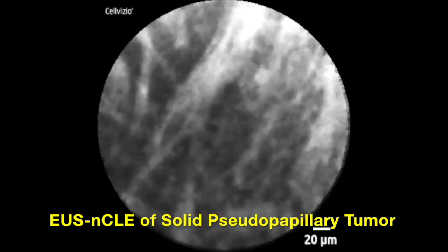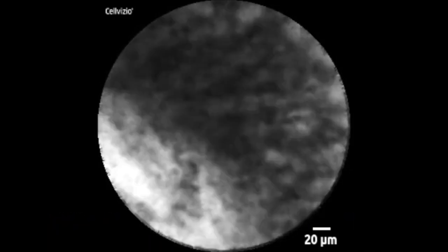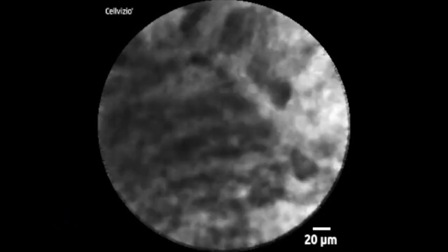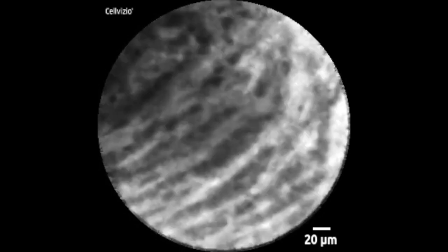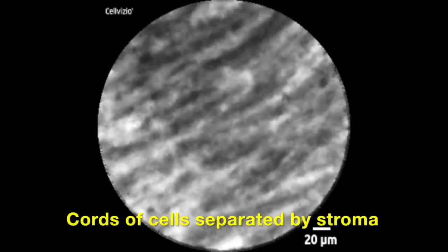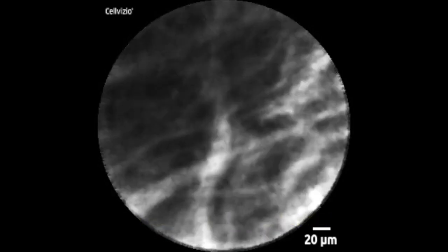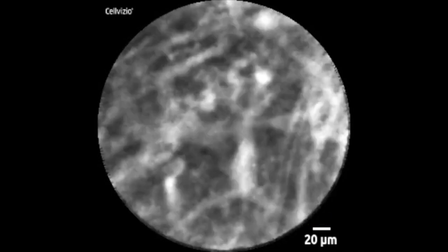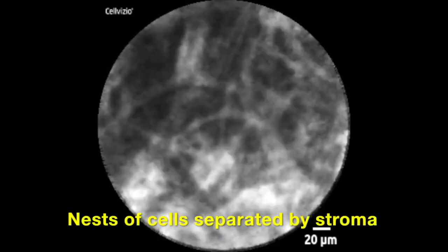Here is an example of solid pseudopapillary neoplasm. Again, very similar to the cystic neuroendocrine tumor. There are cords or groups of cells separated by the cyst stroma. Here you see more cords of cells than nests of cells. The spaces between these groups and cords of cells do not have any red blood cells flowing through them.